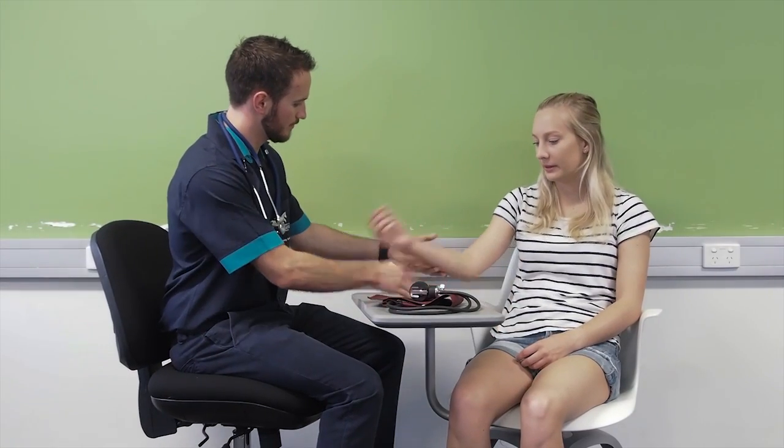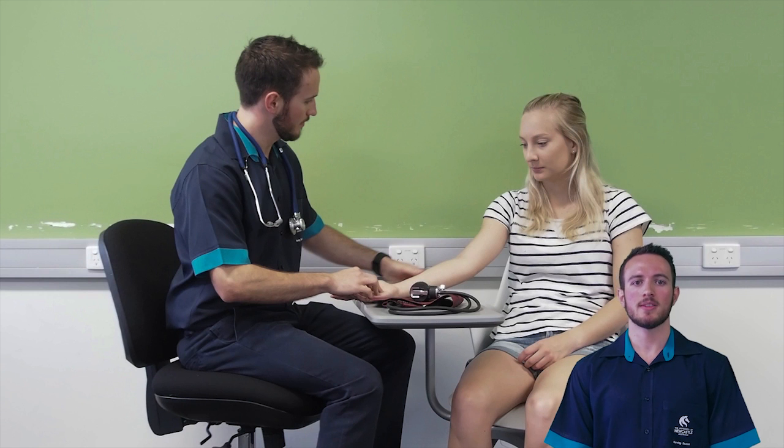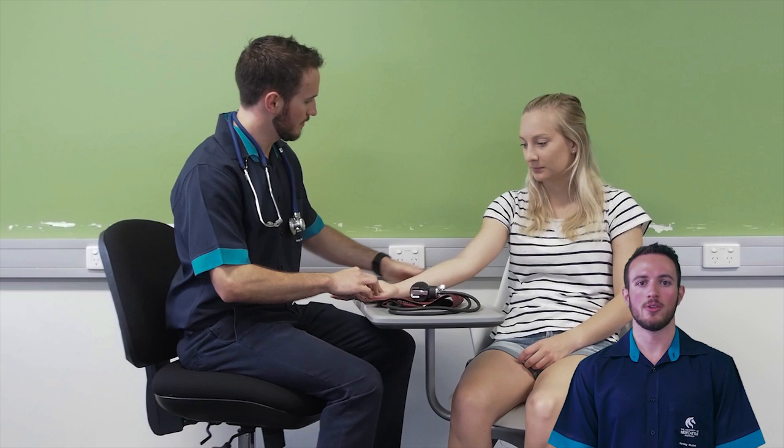Make sure the patient is sitting with their feet flat on the floor. If this is impossible, a semi-Fowler's or supine position would work. Can I just get you to sit with your feet flat on the ground? And can you place your arm up here for me? Expose the upper arm and rest the arm with the elbow extended and palm facing up. Assess the arm and make sure it is suitable — no IV ports, no pain, and no surgical intervention.